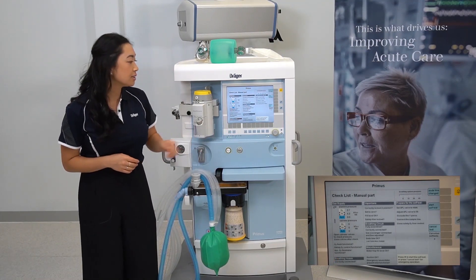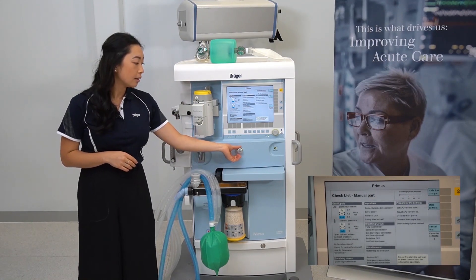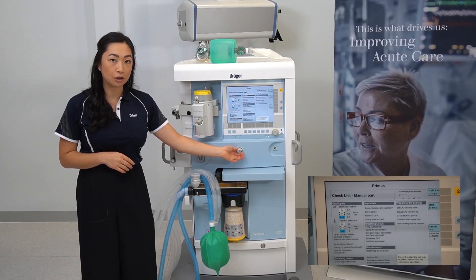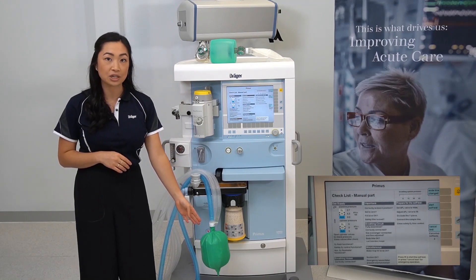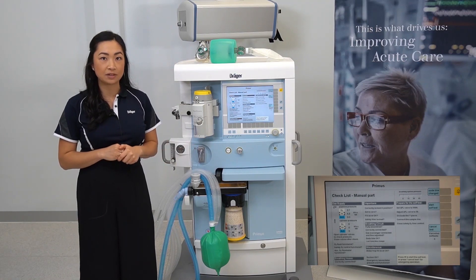To check your safety oxygen control, push in the safety oxygen knob, dial up to a high flow, and look for the expansion of the breathing bag. Your flow is indicated on the outside of the safety control knob. Then return it to its original position.